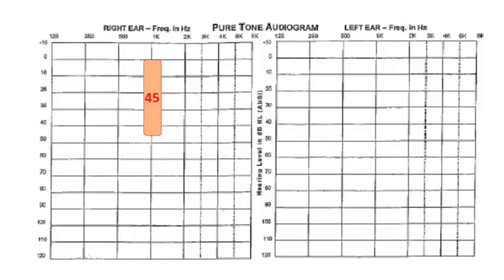A masking noise of 45 dB EML should change a hearing threshold of something like a pure tone up to 45 dB HL. If we now increase the tone's intensity in steps, the subject will eventually be able to hear it again. They should start hearing it at 45 dB HL. At this level, with the 45 dB effective masking of narrowband noise in the ear, they should be able to detect the tone 50% of the time. With this masker present at this level, then, the new masked threshold would be 45 dB HL.